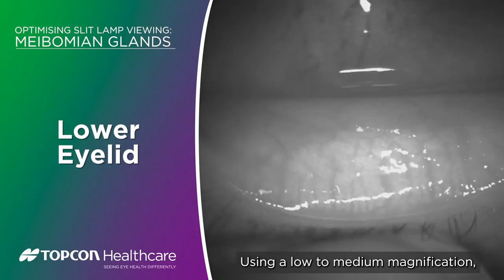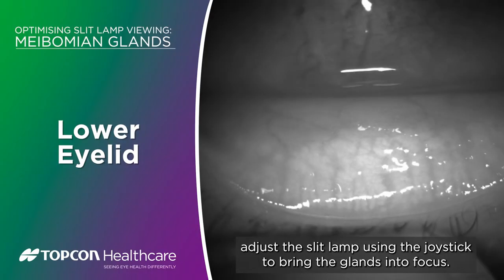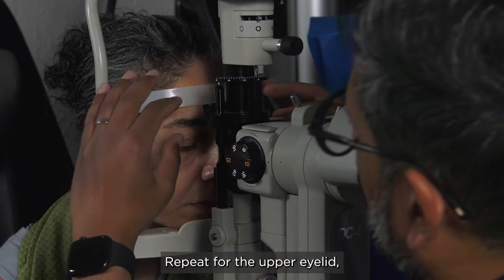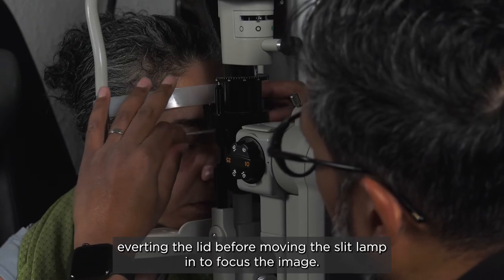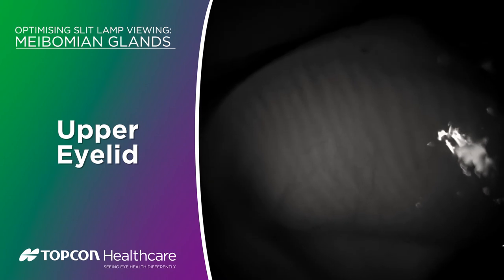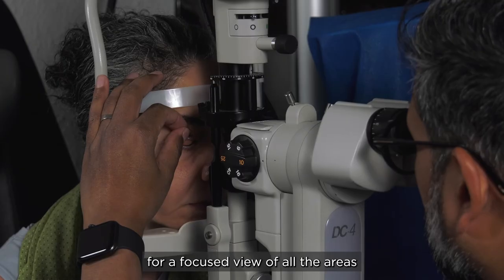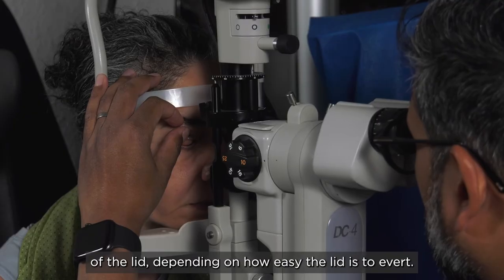Using a low to medium magnification, adjust the slit lamp using the joystick to bring the glands into focus. Repeat for the upper eyelid, averting the lid before moving the slit lamp in to focus the image. You may need to move the slit lamp in and out for a focused view of all areas of the lid, depending on how easy the lid is to evert.